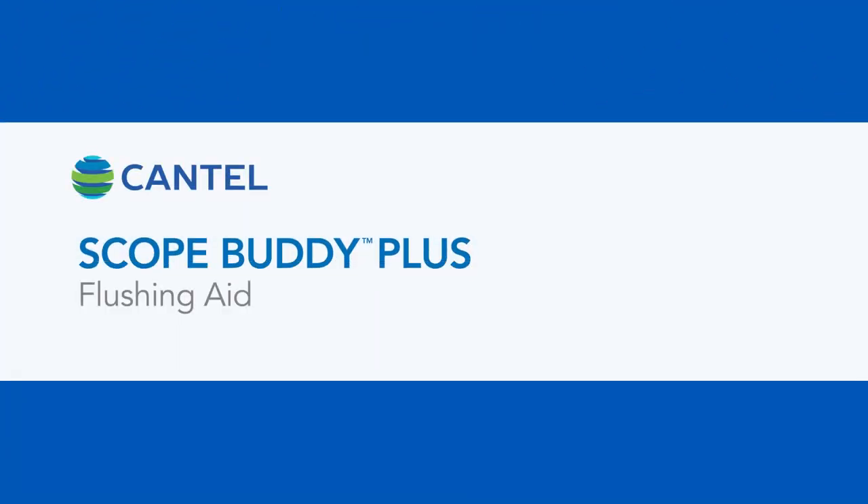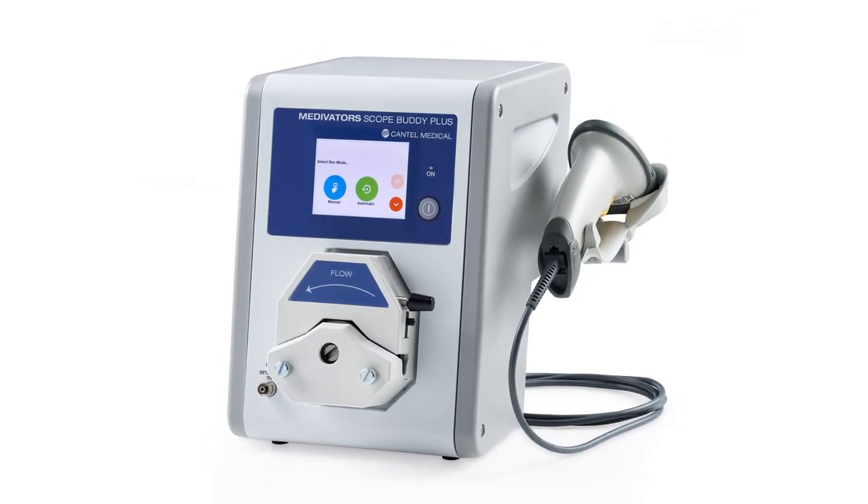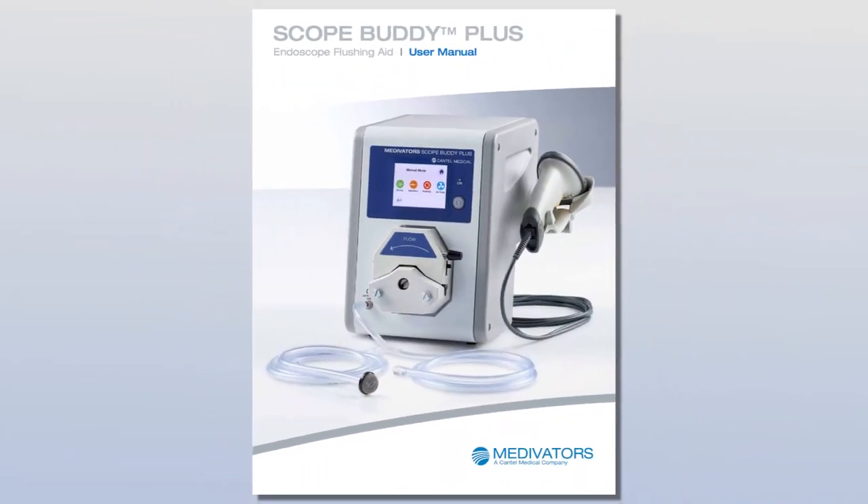Welcome to the Scope Buddy Plus Flushing Aid Overview Training. This video supplements but does not replace the information provided in the user manual that came with your Scope Buddy Plus Flushing Aid.